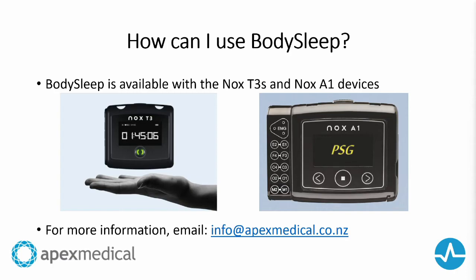So how can you use BodySleep? As I mentioned before, BodySleep is available with the Nox T3S and A1 devices. It does require that your computer is running Noxturnal 6.0 or higher, which I think the majority of you are using. If you'd like to know what kind of version you're using, feel free to give us a call, or if you'd like more info, just give us a call or email us at info@apexmedical.co.nz.